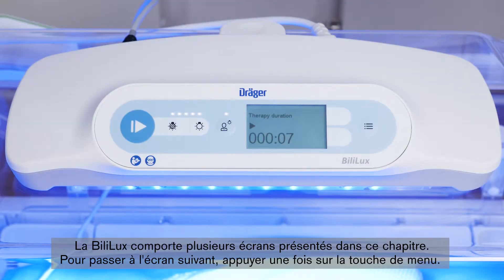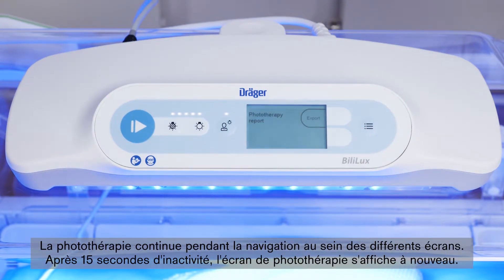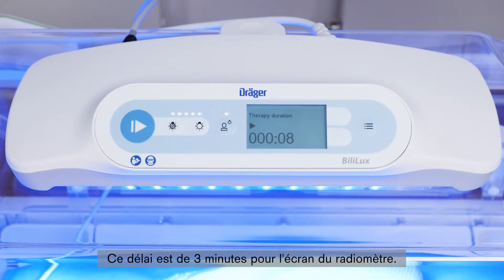The Bililux has several screens that will be explained in this chapter. To navigate to the next screen, press the menu key once. Phototherapy can continue while you navigate among different screens. After 15 seconds of inactivity, the display reverts to the phototherapy screen. Only the radiometer screen reverts back to the main screen after 3 minutes.